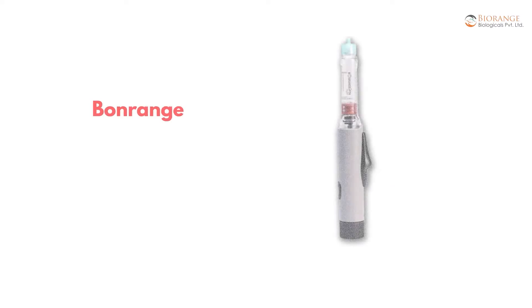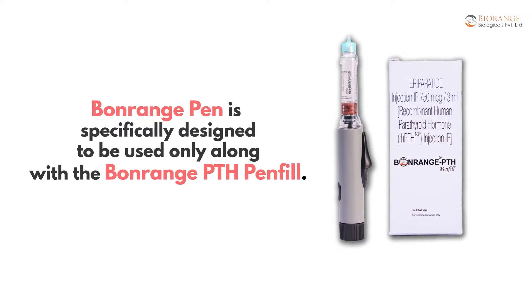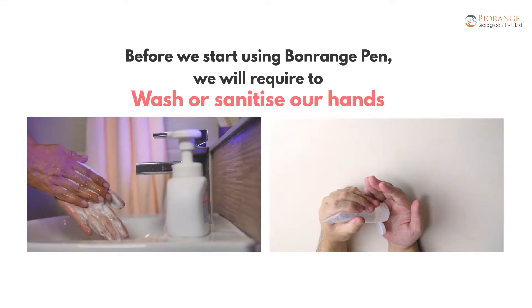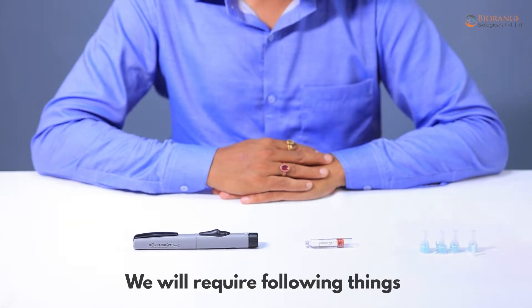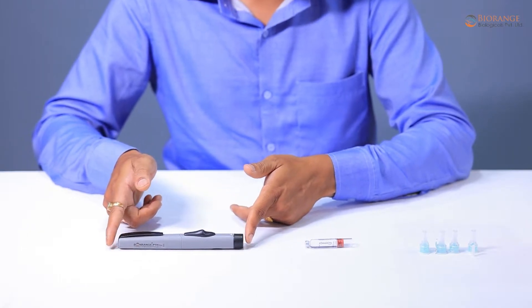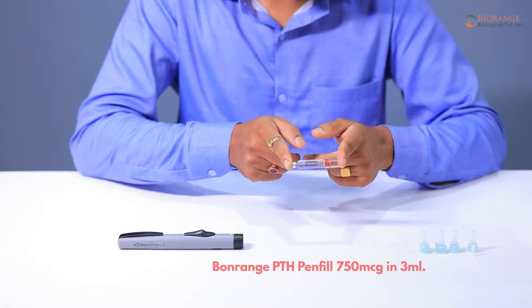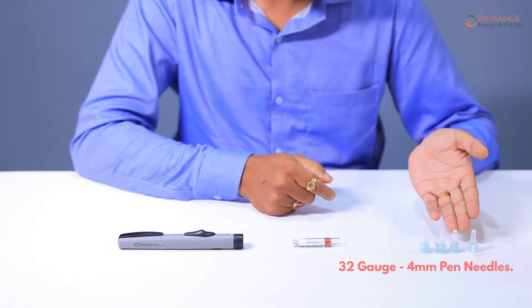Bonrange Pen is specifically designed to be used only with the Bonrange PTH pen fill. Before we start using Bonrange Pen, we will need to wash or sanitize our hands. We will require the following things: the Bonrange Pen device, Bonrange PTH pen fill 750 mcg in 3 milliliters, and 32 gauge 4 millimeter pen needles.